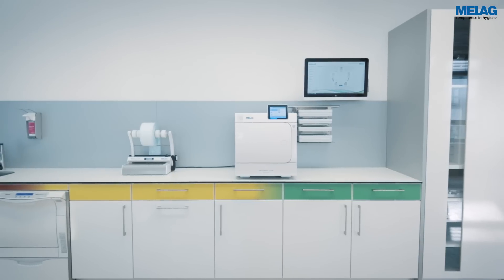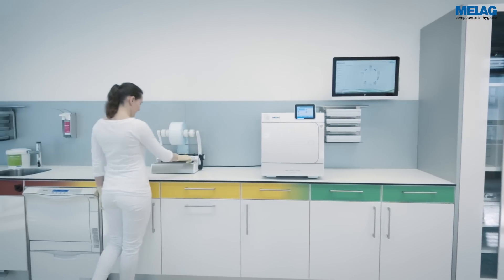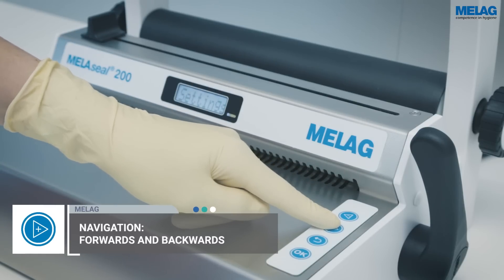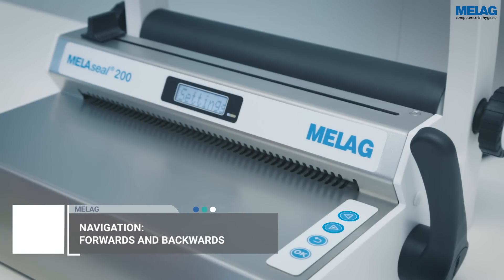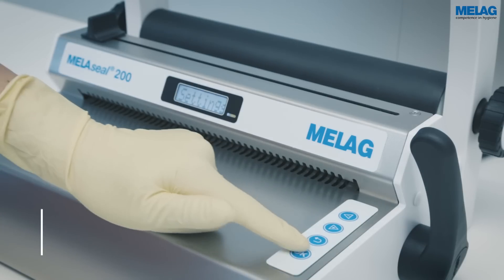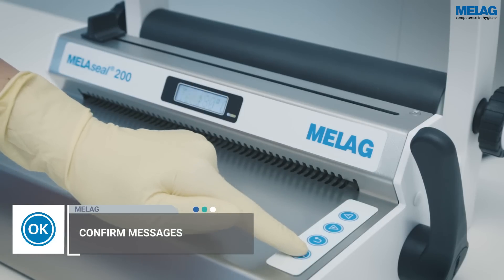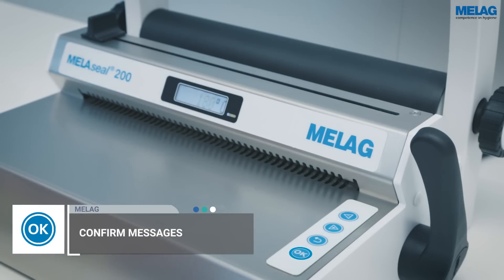Should you need to adjust the ceiling temperature, proceed as follows. Using the plus or minus keys, navigate to the menu item Settings. Click on the OK key to proceed to the submenu. Then confirm the display notification Temp with OK.